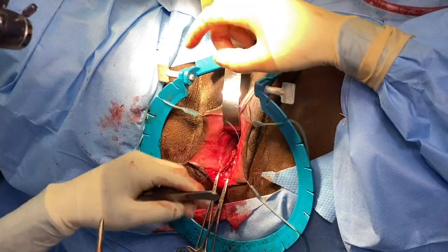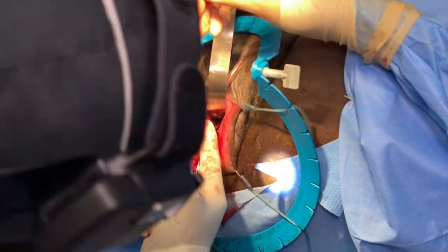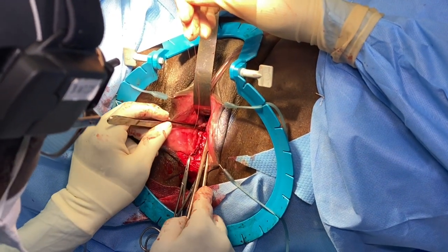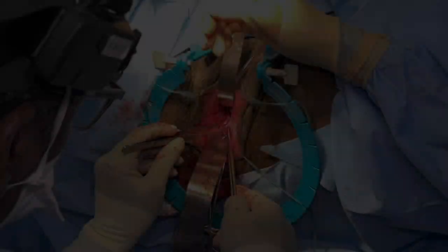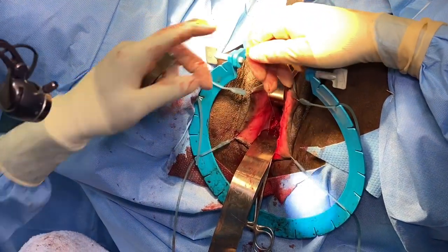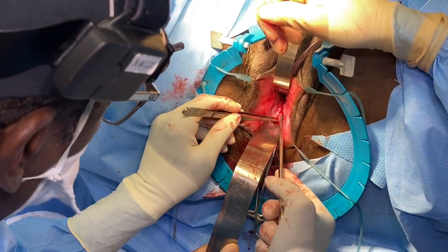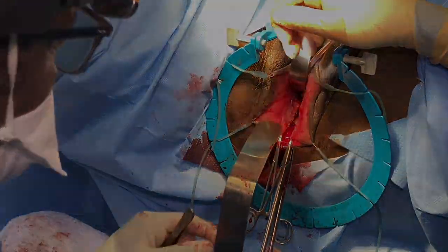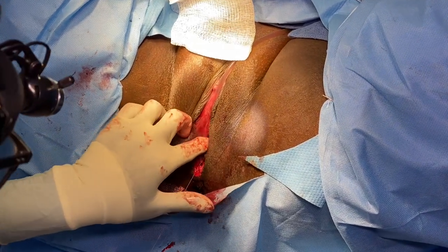First thing that we're going to do, we're going to bring back the edges of the hymenal ring. This is the hymenal ring here. We're going to bring those edges back there. We want everything nice, neat, symmetrical. We'll bring it back in. Again, we'll close it here. A little small bite. We're going to get everything nice and hemostatic. Bring it back in. Now, everything is back together inside. Top wall, anterior wall, bottom wall, posterior wall.